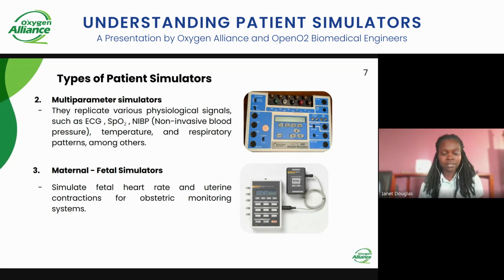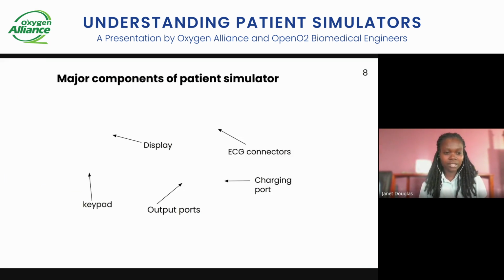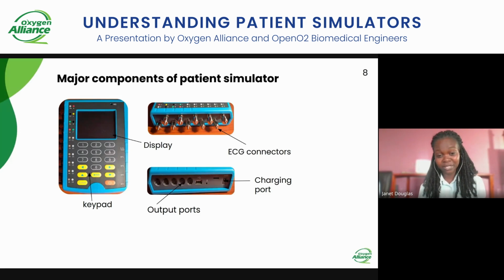Now, we'll look at the major components of patient simulators. In each and every simulator that you see externally, you have a keypad, and you also have a display where you'll be able to see the results. If you're looking at a multi-parameter simulator, you definitely have ECG connectors, because ECG is one of the parameters you find in a multi-parameter simulator.